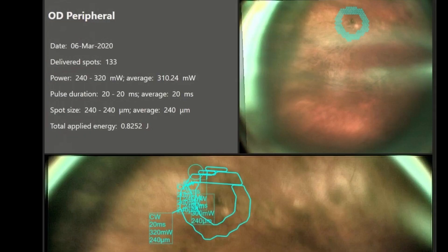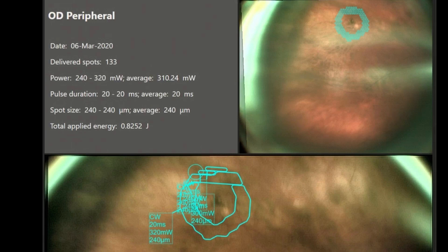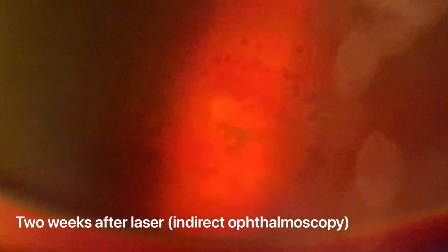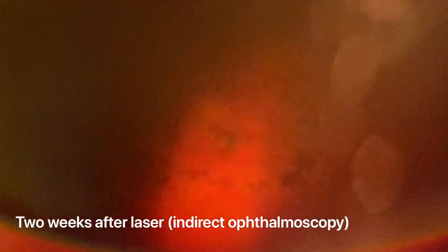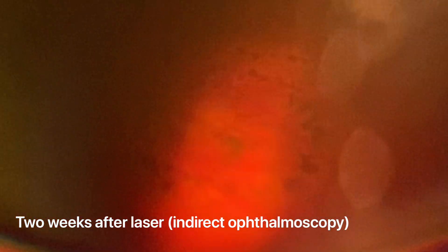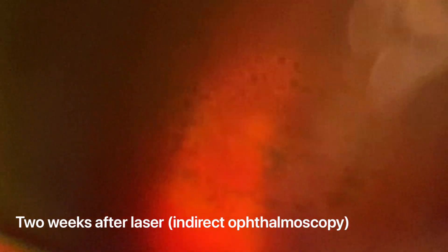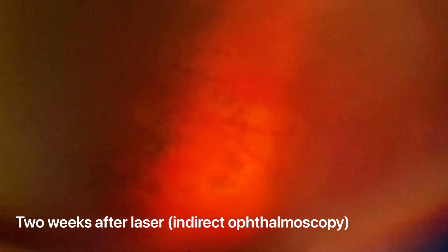A detailed report is prepared at the end of the treatment procedure to document applied treatment energies and patterns. Indirect ophthalmoscopy performed two weeks after laser reveals the row of confluent pigmented coagulates.